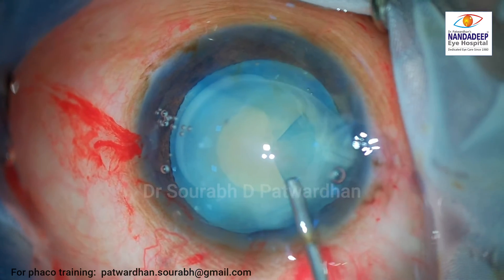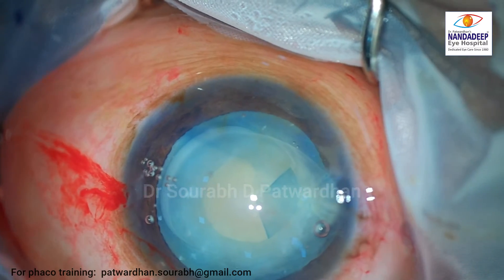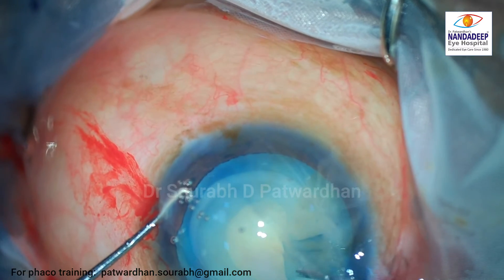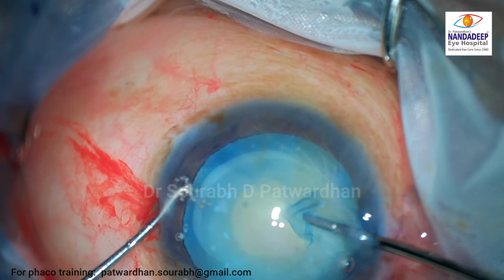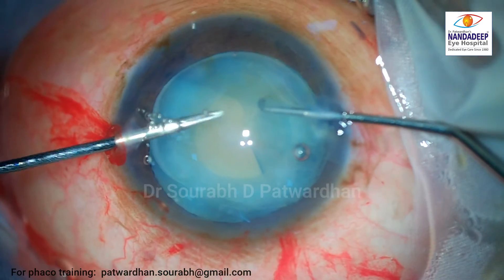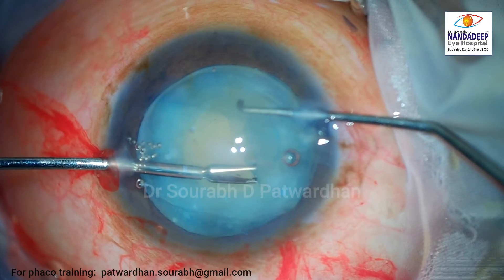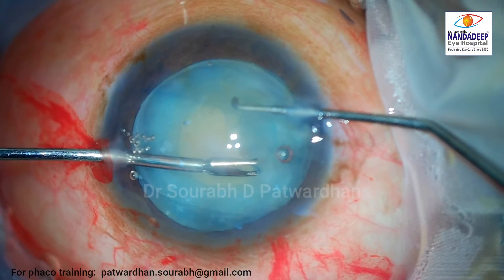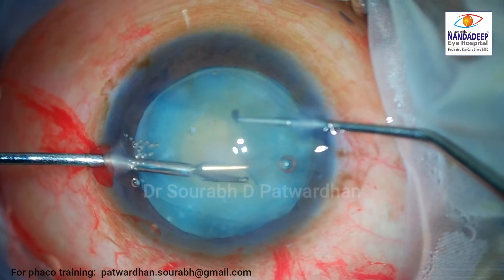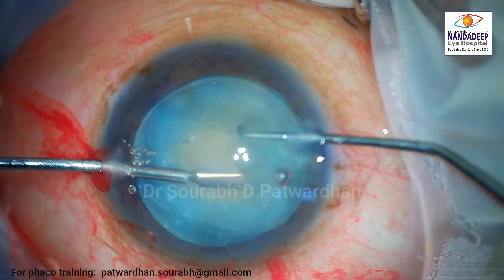The surgeon proceeds slowly but was feeling a little bit of resistance to the capsulorhexis. The surgeon decided to put more OVD and again try to advance the rhexis, but as you can see it's not tearing. So the surgeon decides to go with the non-dominant hand, and as you can see there are tremors — that's because we are not used to using our non-dominant hand.